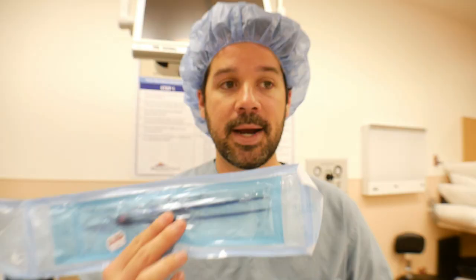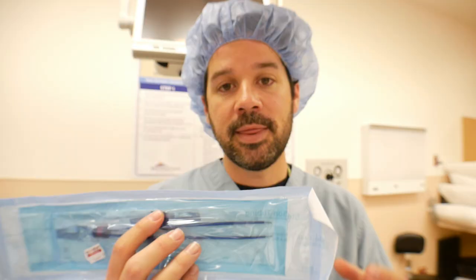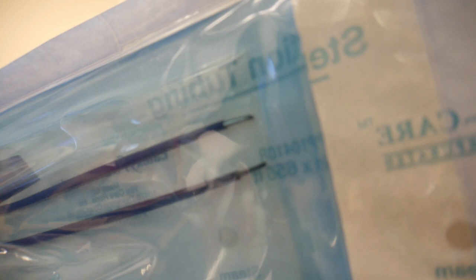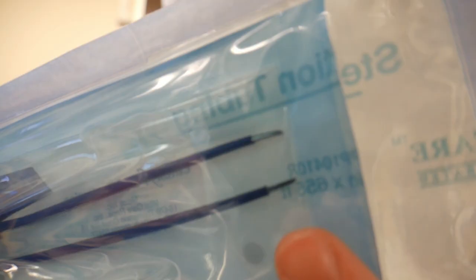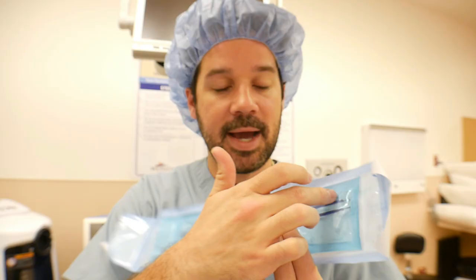Bipolar is something entirely different. It's similar in that it does coagulate and cauterize tissue, but it does that in between the two prongs of the actual forcep itself. We have two little metal tips on the forcep — the top one is the active electrode and the bottom one is the dispersive electrode. So you actually don't even need a cautery pad on the patient's body. The whole forcep serves as both the active and the dispersive electrode.